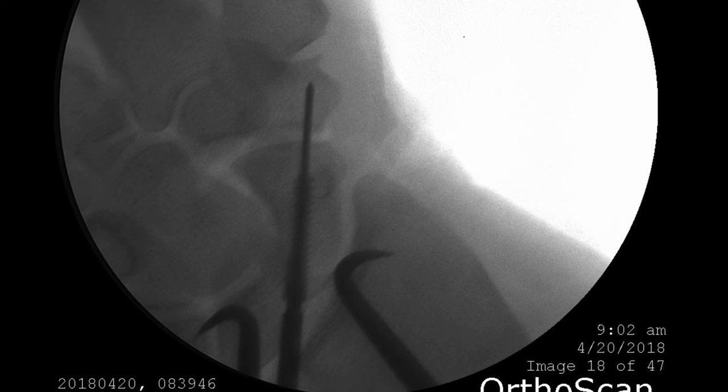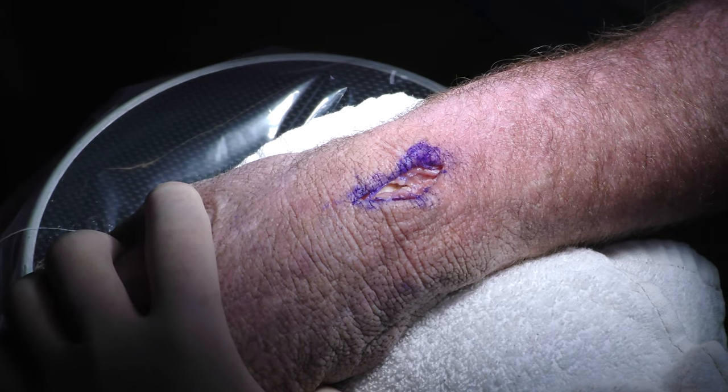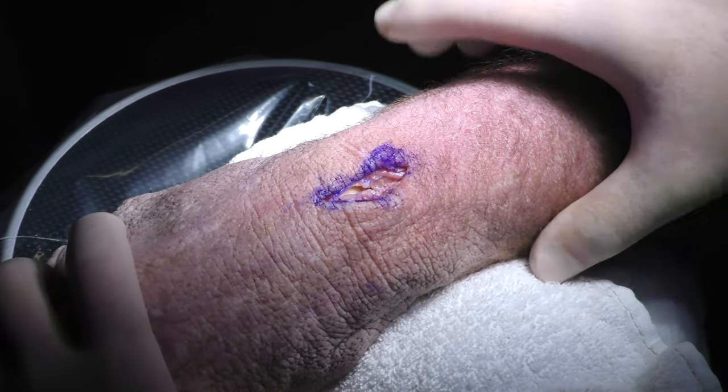One thing I can say is there's tremendous compression with the Acutrak 2. And so when your fracture is reduced and you're putting it across the fracture site, it will close that down. So always make sure that you put in a screw that's 4 millimeters shorter, or you're going to be too long when you're done.